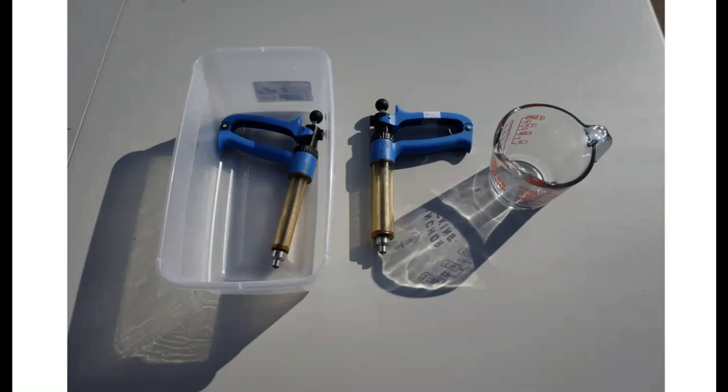I use distilled water versus tap water because some tap water has quite a bit of mineral in it. Plus, if they've had some kind of leak and they've spiked with a high dose of chlorine, you don't really want that sitting in your barrel if you're going to be using a modified live vaccine later. So I just get a gallon jug of distilled water, really cheap, and fill up my glass measuring cup. I'll take my metal transfer needle, rinse it real quick, and drop it in the distilled water. Then I'll put the measuring cup in the microwave until it starts boiling. After that, I'll pull it out, draw up that boiling water, and flush the syringe out 6 or 8 times.